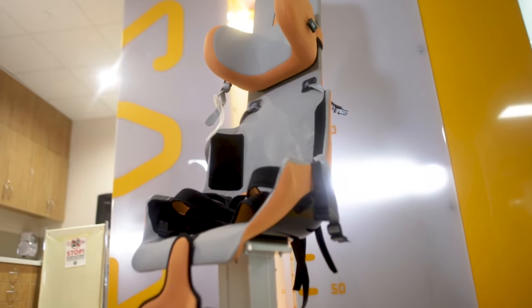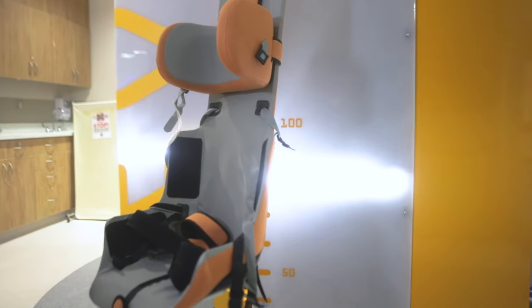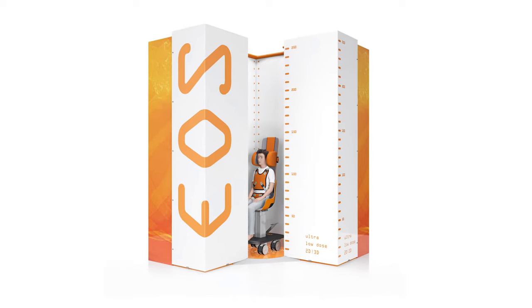For our patients in wheelchairs, we have a special chair that allows the patient to be easily transferred in and out, fully supported from their wheelchair into the chair, get their imaging, and then right back into the wheelchair.